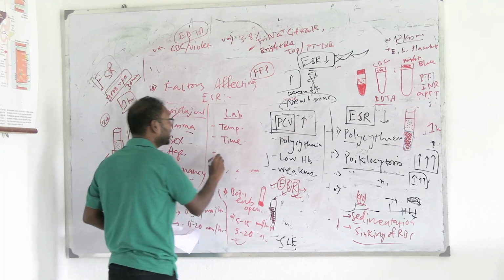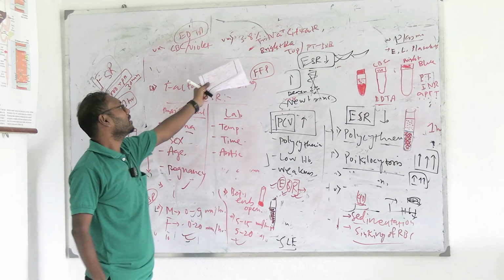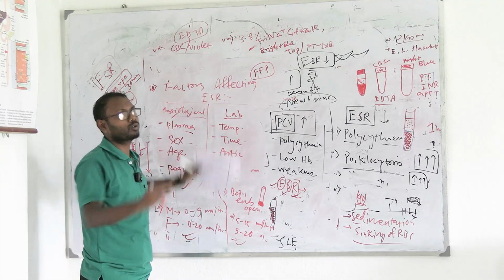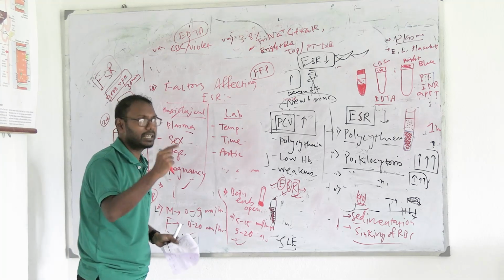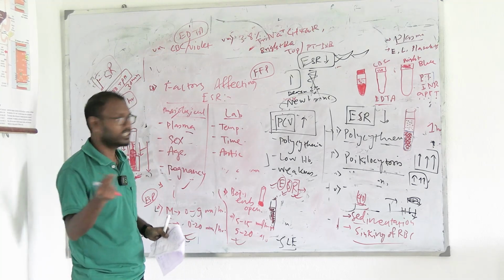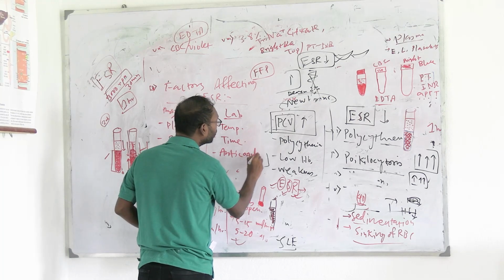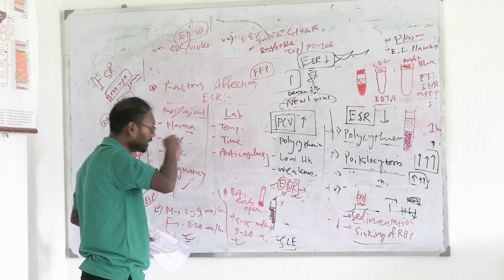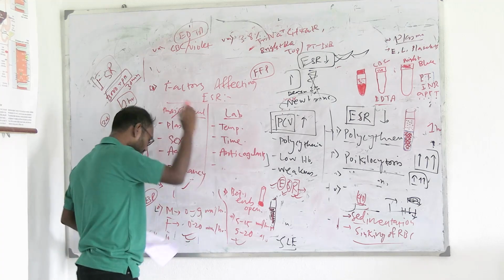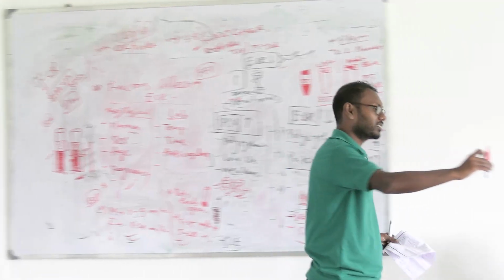Third is anticoagulants are also important. Anticoagulants we use, so if there is any impurity in the anticoagulants, sometimes the anticoagulant is too much or too little, or the tubes are faulty themselves, where you stored the anticoagulants, so problems can occur. So anticoagulants also need to be in good shape, in perfect shape, so that this test can work properly. So anticoagulants are also a factor. Okay, next, tilting of tube. The tubes need to be put straight.